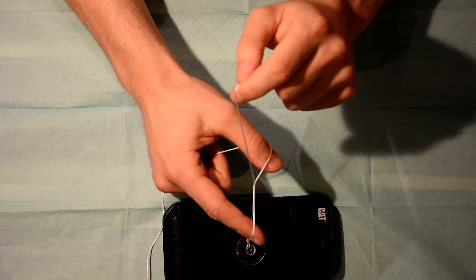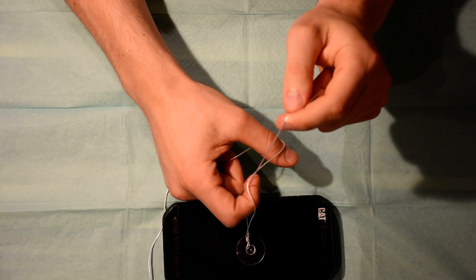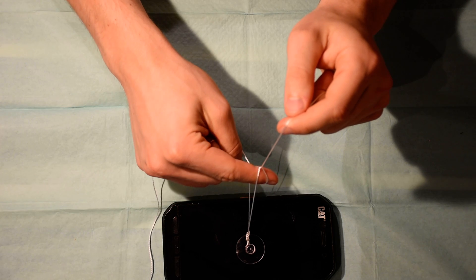Then you take your index finger, take it behind the fixated cord and you loop it around your original cord like this.